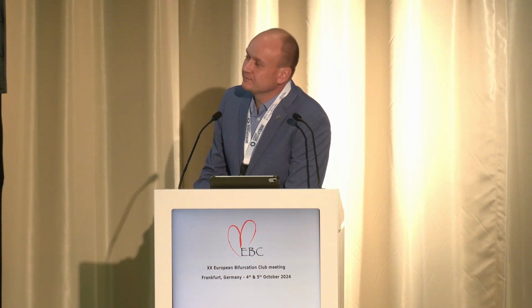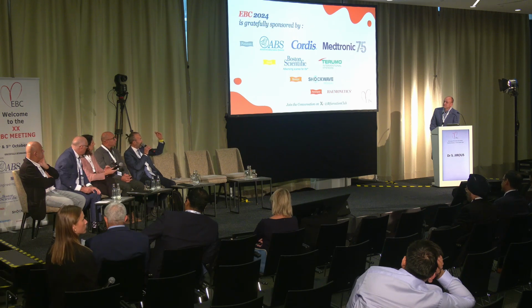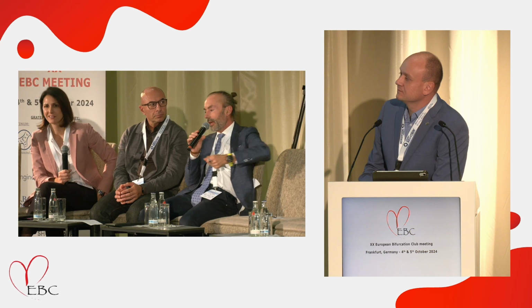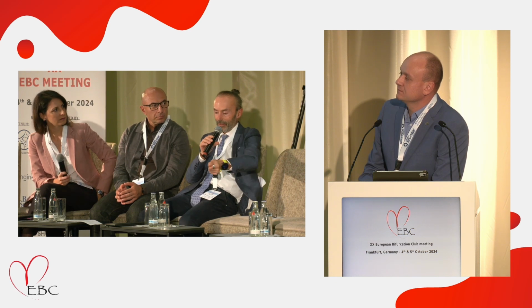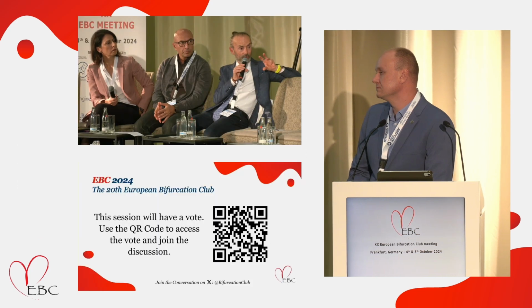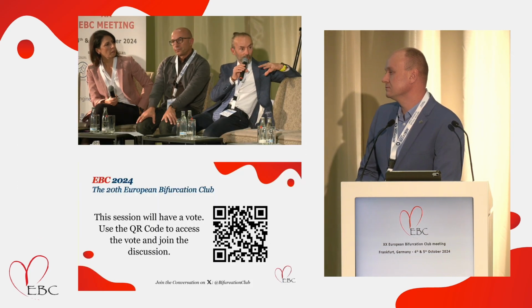I have also a comment. Sometimes when you see this eccentric calcium at the roof of the left main, it's a nodule. And a nodule is very difficult to treat, even with the rotablator, directional or orbital atherectomy. It's not perfect, but there are some case reports of using IVL in calcified nodules. You can crack these, and then that allows you to proceed.